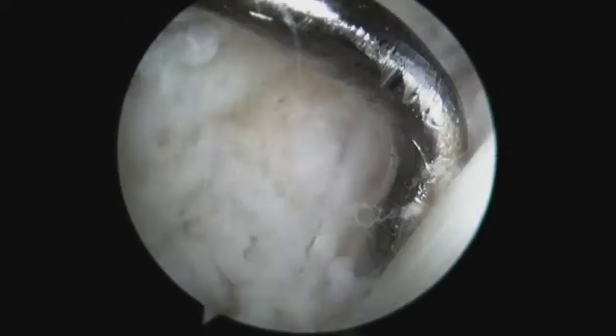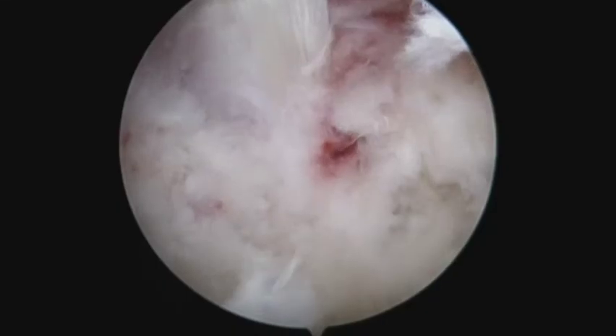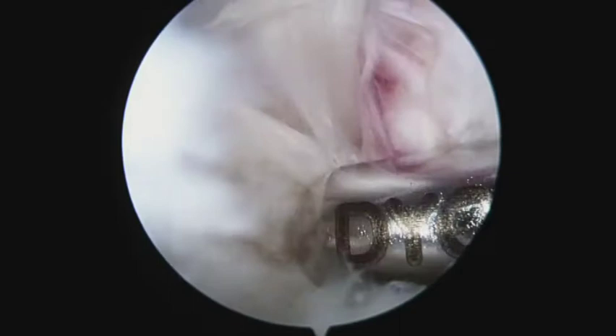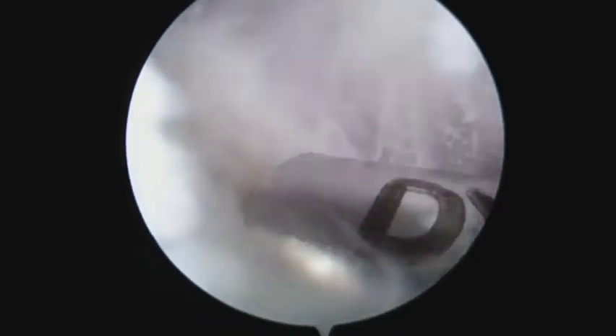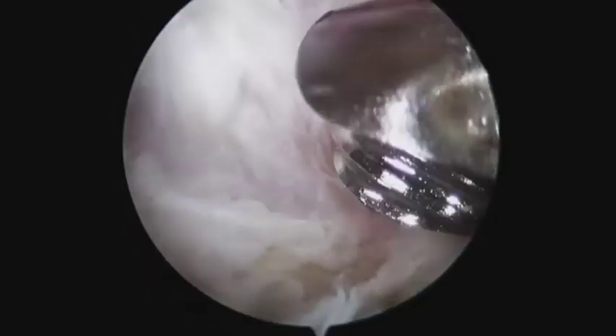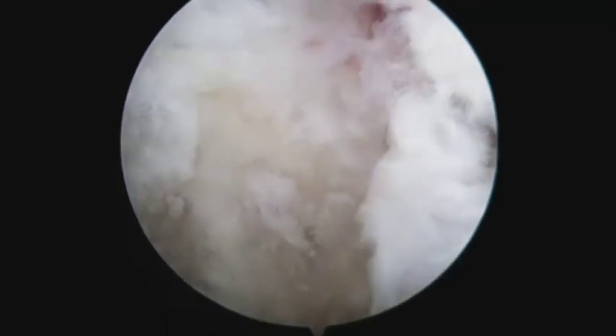The fatty tissue is resected to expose the superior cortex of the fibular head. With the proximal and posterolateral portals as the viewing portals, a cortical window is created at the superior part of the fibular head by means of an arthroscopic burr through the proximal anterolateral portals.